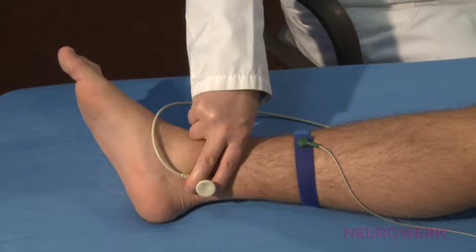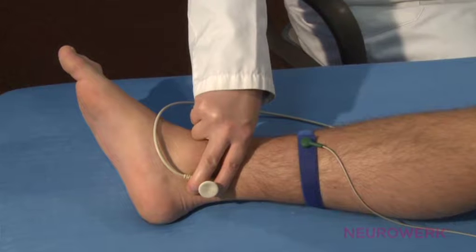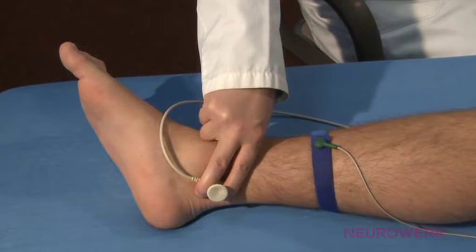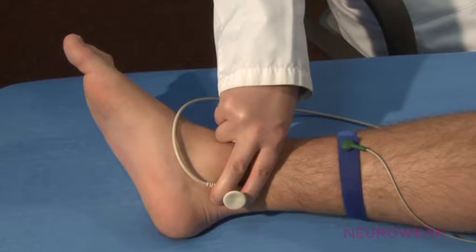Stimulation takes place above the pathway of the tibial nerve and below the medial malleolus. It should be considered that the cathode of the stimulating electrode is directed to the proximal, towards the head. The ground electrode is placed on the lower leg of each examined limb. It should be taken into account that the ground electrode is always moist and fastened tightly.